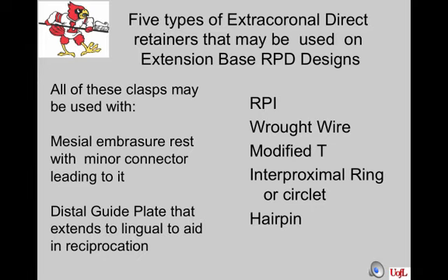This design eliminates the need for the lingual clasp arm. It places the fulcrum anteriorly to make better use of the residual ridge for support and provides stabilization against horizontal rotation of the denture base.